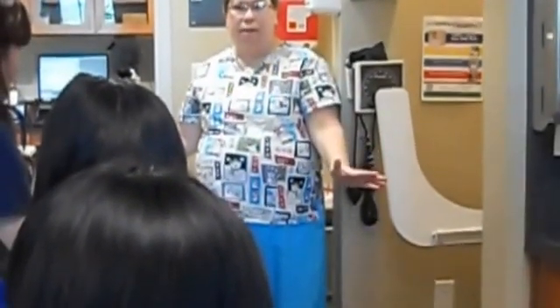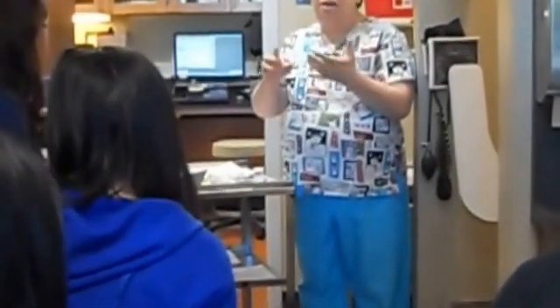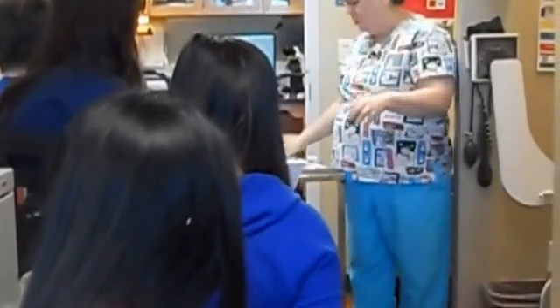So how many of you all think that you're proficient in phlebotomy? Just raise your hand. Sure. Okay. Let me explain that phlebotomy means puncture. It doesn't mean venipuncture. It could encompass a venipuncture, a hand stick, a heel stick, or a finger stick. And I know that not all of y'all know how to do all that. So y'all are not proficient at phlebotomy yet, but it's okay. You will be by the end of this presentation.